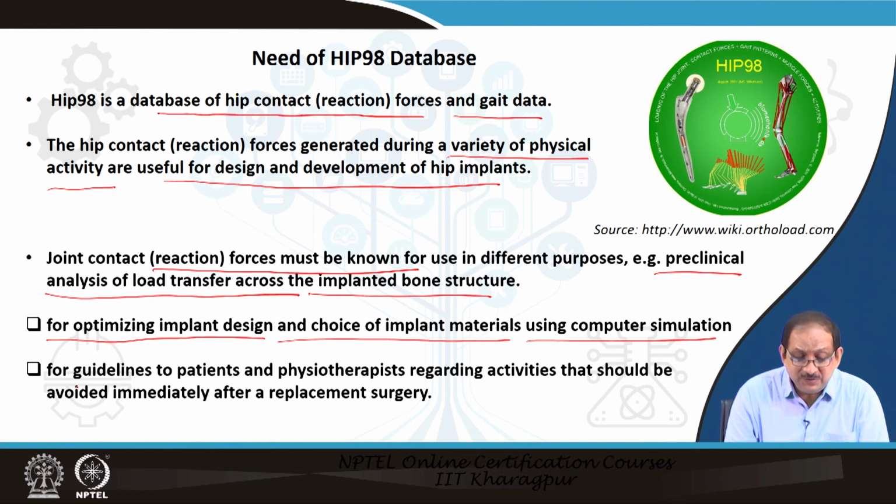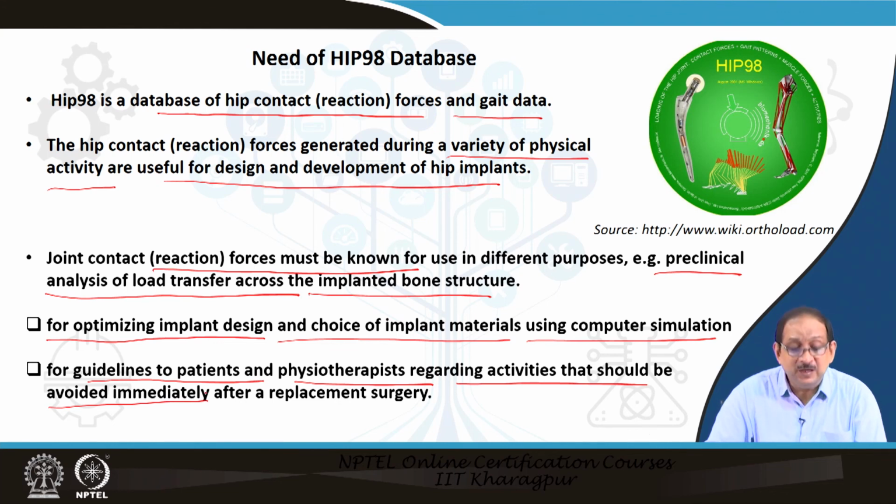It can also serve as guidelines to patients and physiotherapists regarding activities that should be avoided immediately after the replacement surgery is done on a patient.